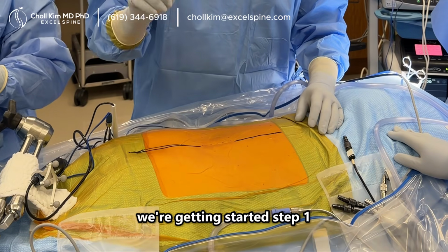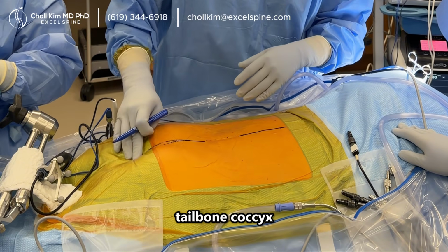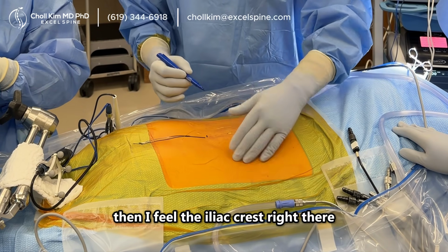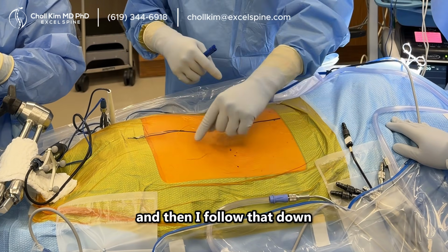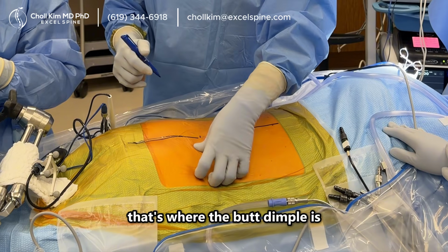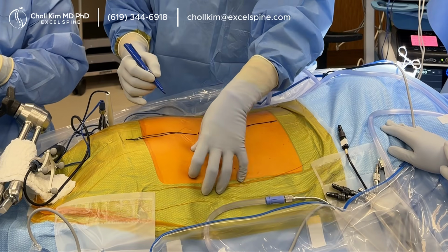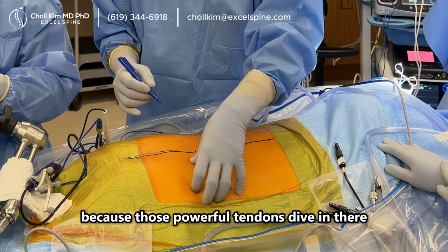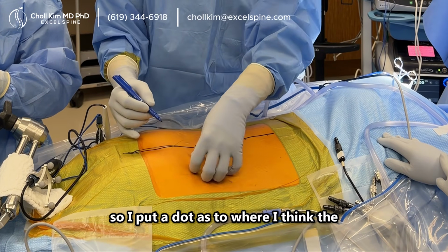We're getting started. Step 1, identify the landmarks of the spine using anatomy. Tailbone, coccyx, spinous process, straight line, station at a previous incision. Then I feel the iliac crest right there. And then I follow that down to the posterior superior iliac spine. That's where the butt dimple is. It's the powerful tendon attachments, or the confluence of the tendon attachments, to the gluteus, paraspinals, and obliques. And that's why there's a dimple, because those powerful tendons dive in there and attach all those muscles to the pelvis.